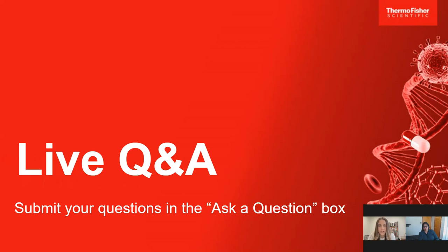Avoiding heating for antigen retrieval, would you like to recommend any antigen retrieval buffer, any methods or techniques? Sometimes it's very important to do the antigen retrieval. There is no choice. You are not getting any staining and you have to do it. In that case, what I suggest you try, if you are using a citrate buffer, is to use a lower pH of citrate buffer instead of pH 9. With pH 9, you will get bright signals, but there will be tissue damage also. So I recommend a lower pH of citrate buffer.